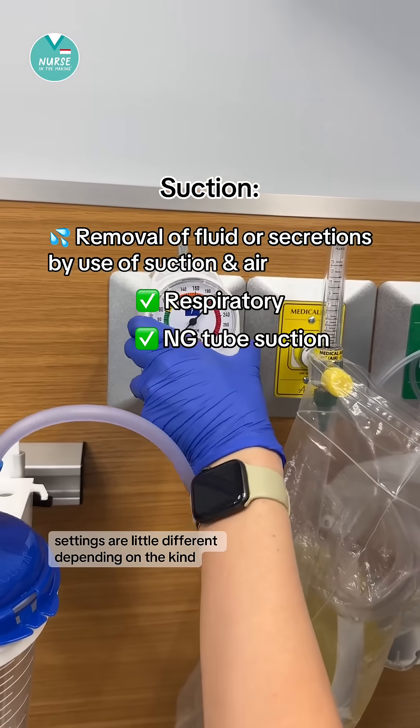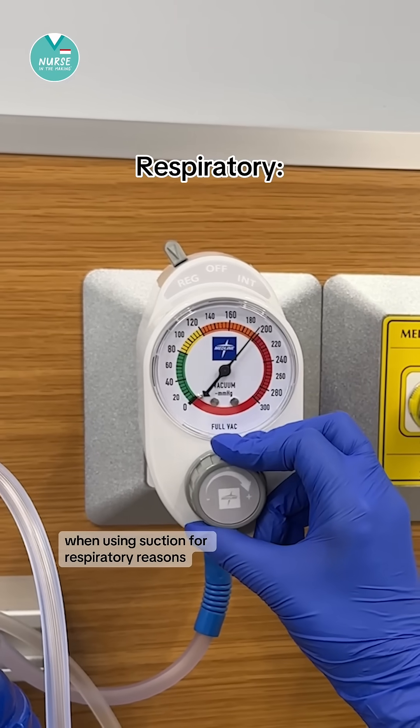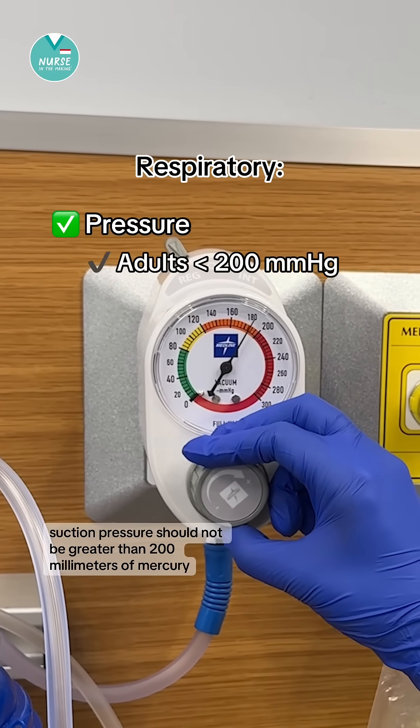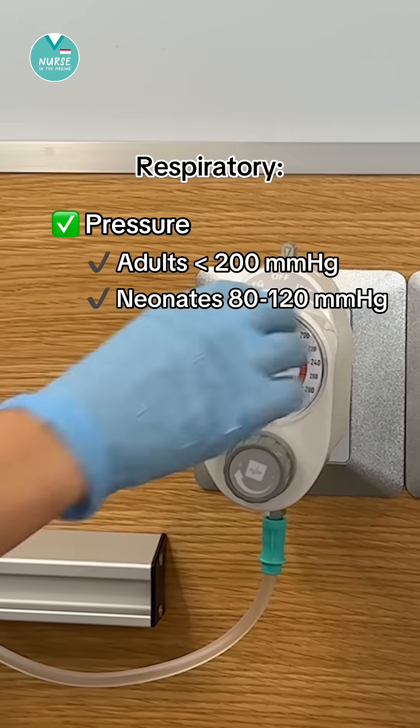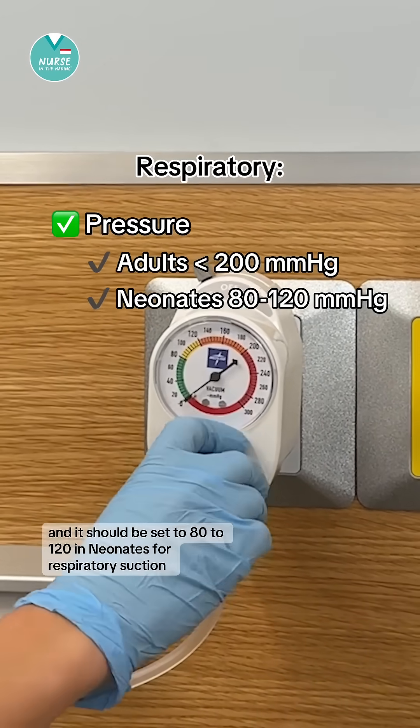Settings are a little different depending on the kind. When using suction for respiratory reasons in an adult, suction pressure should not be greater than 200 millimeters of mercury and it should be set to 80 to 120.